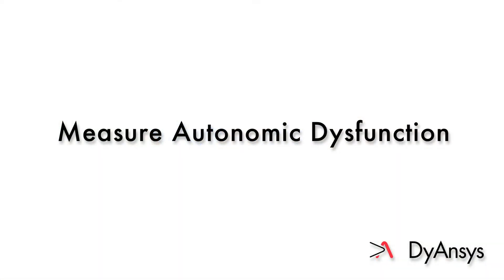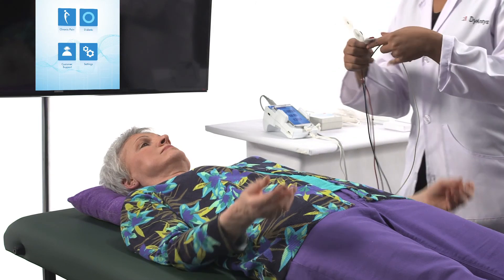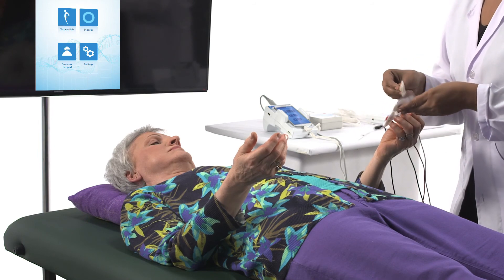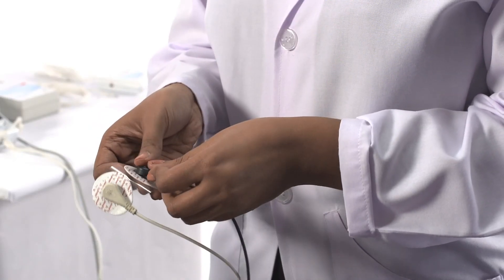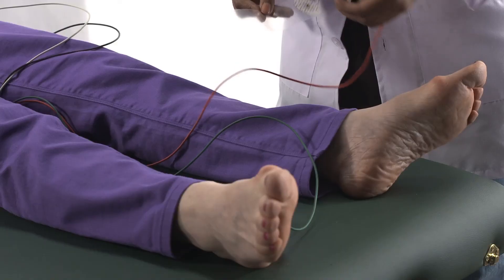Measure the autonomic dysfunction. Note: this measurement is not permitted for patients with pacemakers. In a quiet room, position the patient comfortably on their back. Shoes and socks are okay as long as their ankles are exposed.